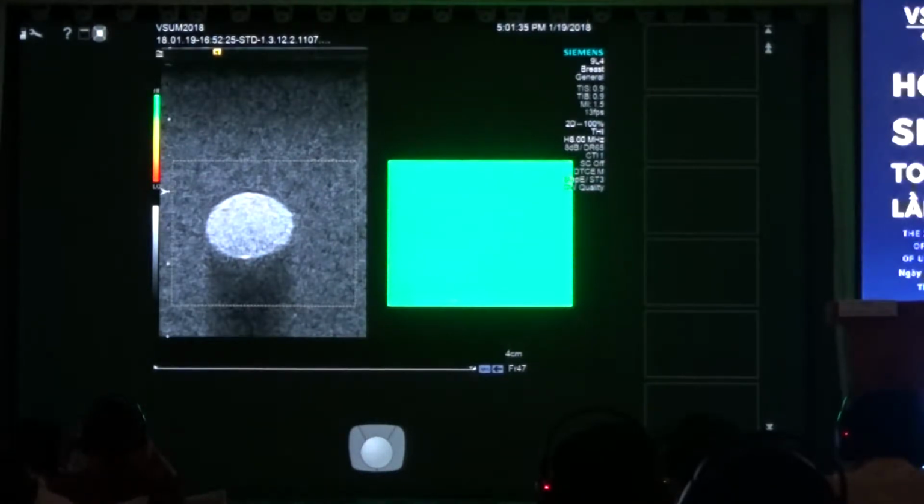If we had an area, like in breast cancers, when I talked about soft cancers, you'll see in this map that it'll be red. That'll tell you that although the system calculated a shear wave speed, when the computer looked at the information that it used to do that, it was not very good, and you should not believe those values. And again, this mostly only occurs in breast, because most of the other lesions that we see in other organs are not as stiff as breast cancers.